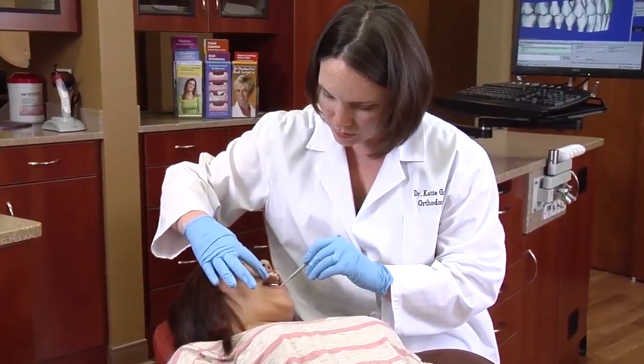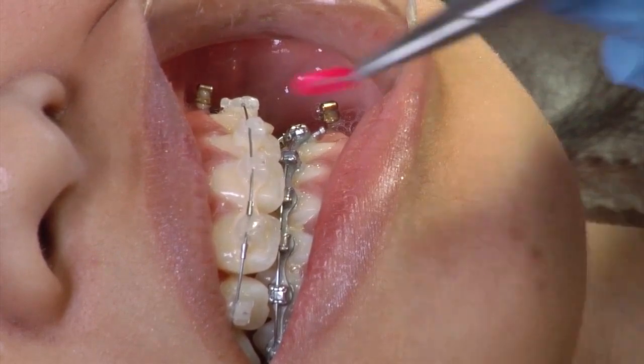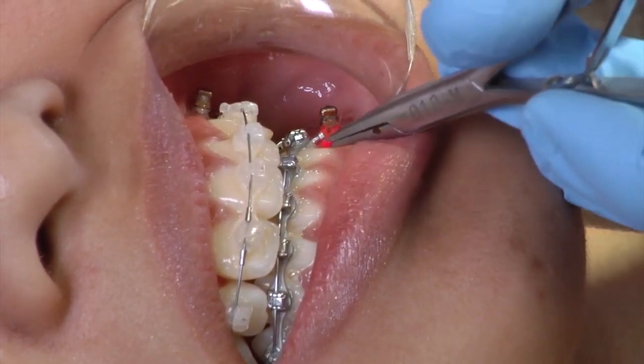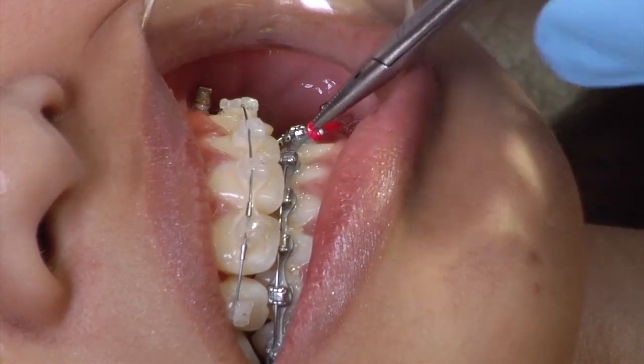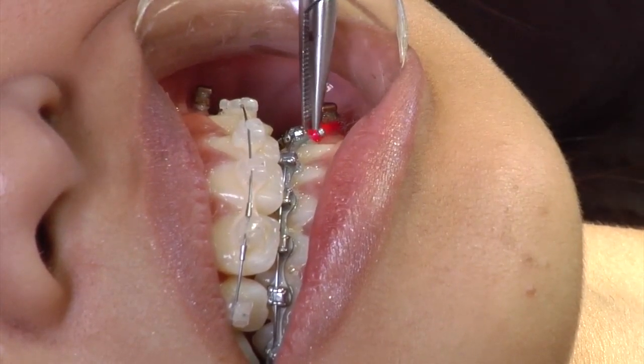A TAD may also come loose over time. Remember, it is a temporary implant that may lose its solid feel and need to be replaced. TADs contribute to predictable results. They allow an orthodontist to move teeth in directions that appliances on teeth alone cannot accomplish. TADs can shorten treatment time and may be used in patients of any age and in many different areas of the mouth.